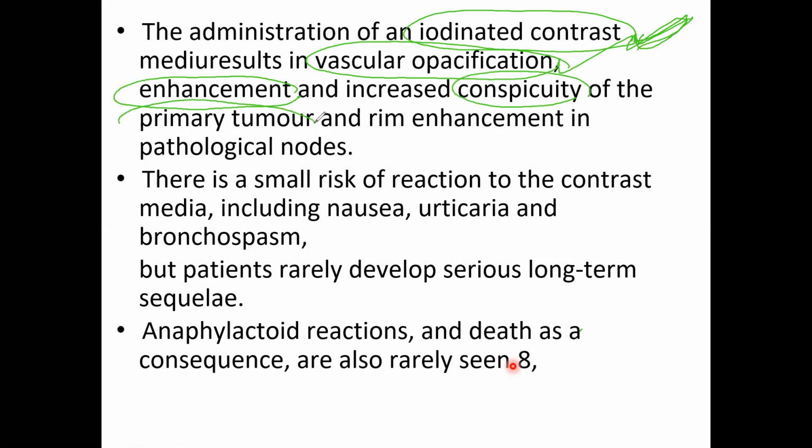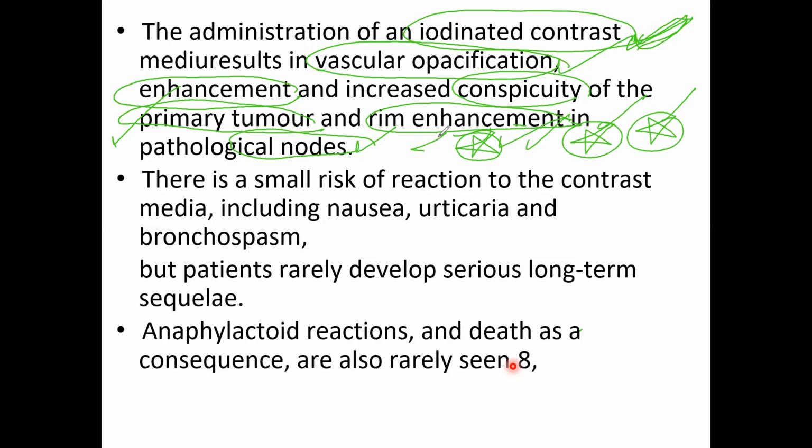The tumor is enhanced with this particular thing. This is the conspicuousness of the primary tumor, and there is also rim enhancement of the pathological nodes. These lymph nodes show rim enhancement, very importantly.